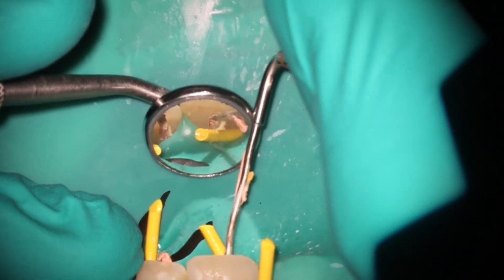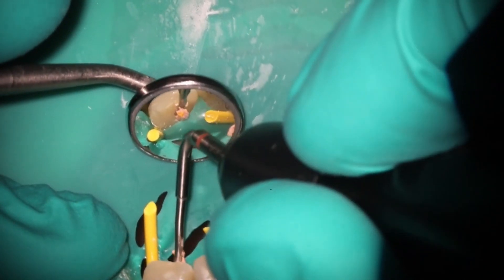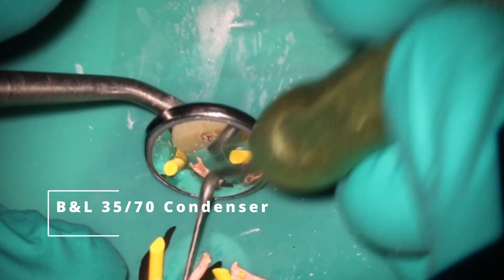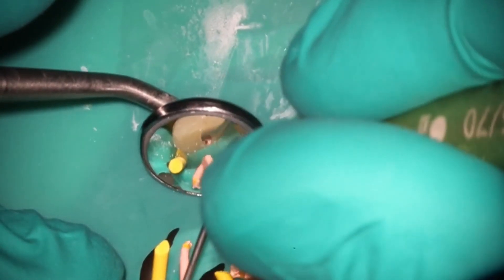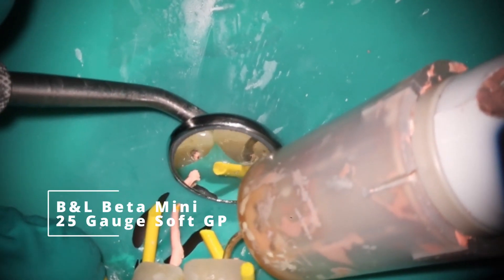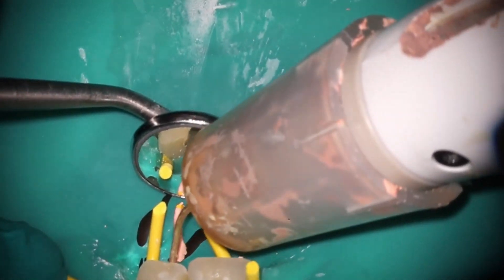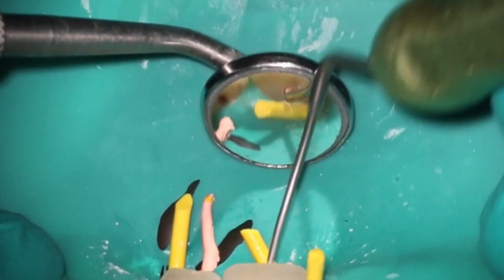I'm going to use a slightly larger tip for the alpha — a 5504 tip instead of my normal 4504. The reason why is because of that 08 cone to begin with, it's just going to be a little bit bigger. I found you can use the 3570 condenser like you would normally. This is about as large as I would feel comfortable using the 35 on. It would probably move up to either a 40 or 45 if it was a little bit larger, just because that skinny side is just a little too skinny. In this case I'm not actually going to be doing the restorative, so go ahead and backfill the case with the beta like we would normally. Smooth that all off.